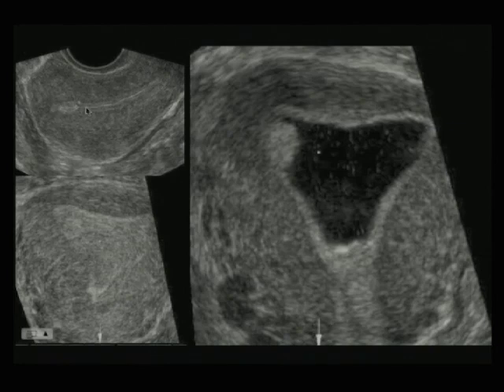Here's a regular 2D, and this shows you that there is a little polyp right here. So then we can do a 3D and show the coronal plane with the top of the uterine cavity right there, and here's our polyp right over on the side. And that may be enough. But if you want to, you can also include some fluid that you can inject through a small catheter and outline the entire polyp very nicely.